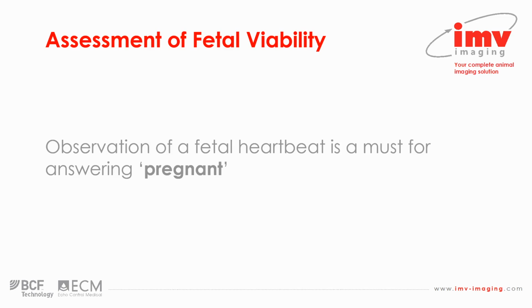To say pregnant without seeing a fetal heartbeat, unless you're much later on in pregnancy and gestation, and you have a calf that's over a pelvic brim and you've got huge cotyledons and so on, that's obviously a different matter. But if you are assessing fetal viability in early pregnancy detection, as is going to be most relevant with ultrasonography, then you really should be considering observation of a fetal heartbeat as mandatory.